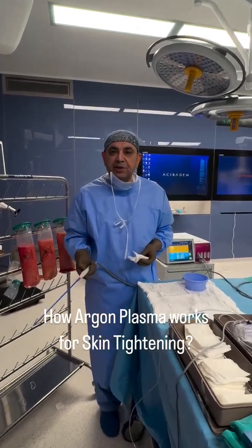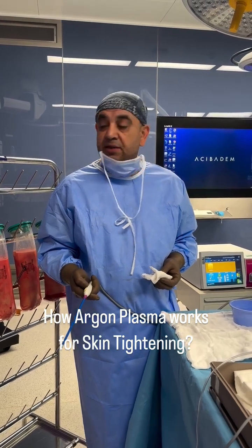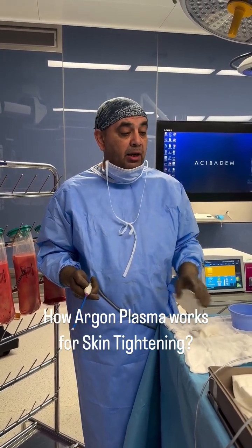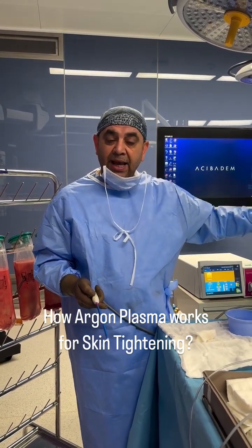Today I am operating on a stage 2 lipedema patient from Florida, United States. I completed the back of the patient, and I am now doing the arms and full legs.